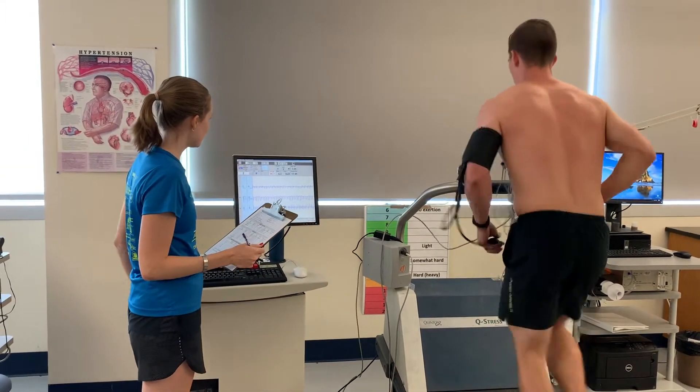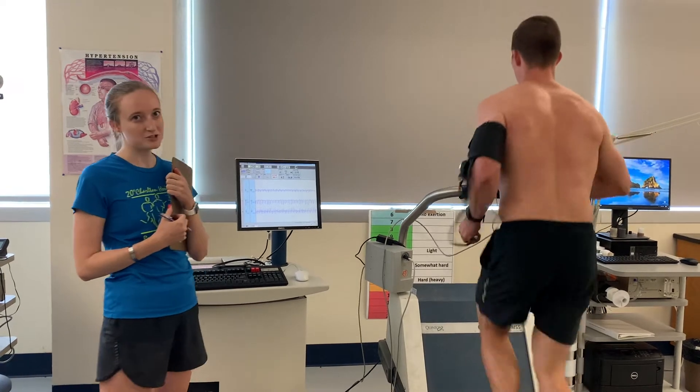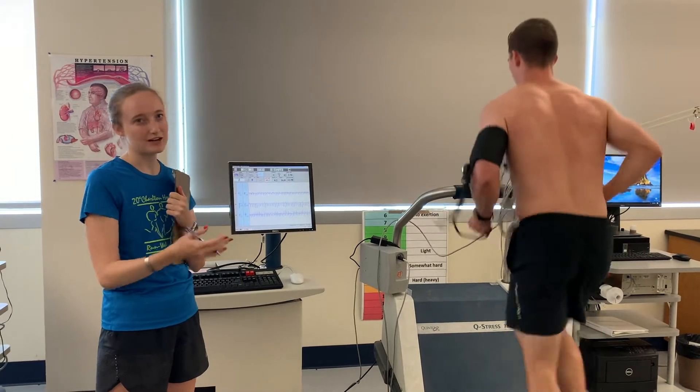Still got about 15 more seconds in this stage before we go up. Just a reminder — the second we hit 170, we're going to go ahead and stop the treadmill and we'll get him down to recovery.